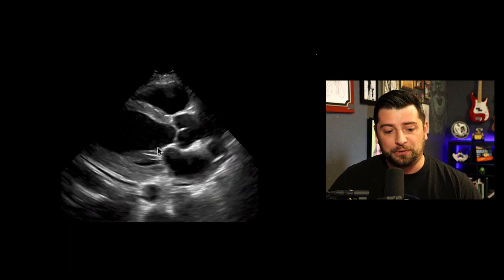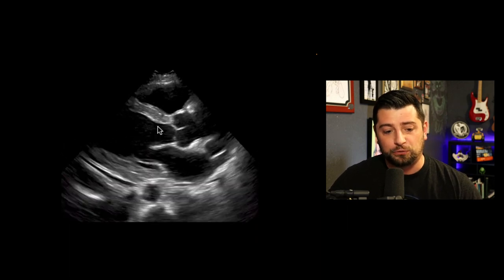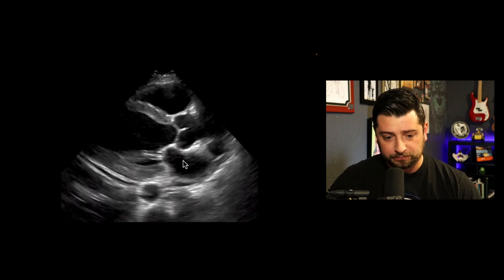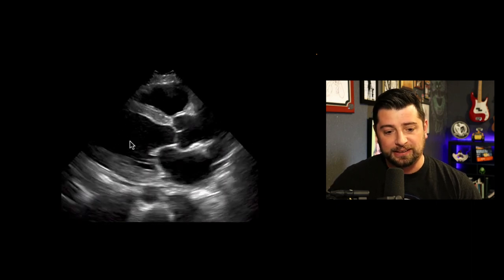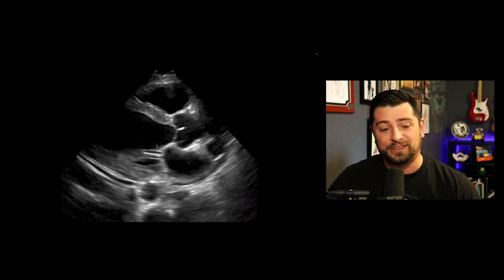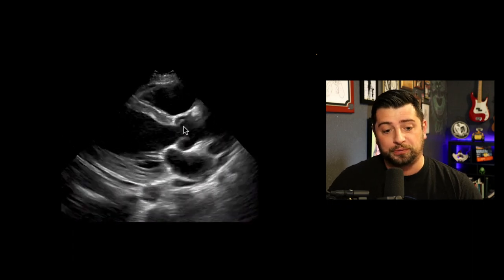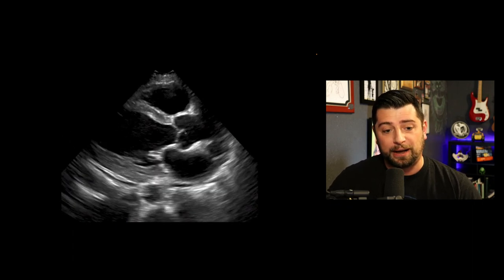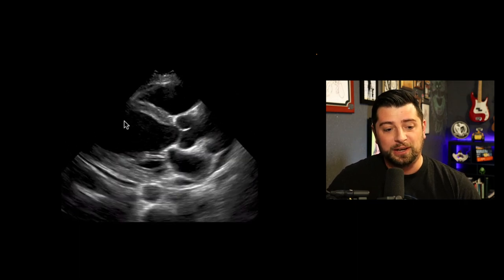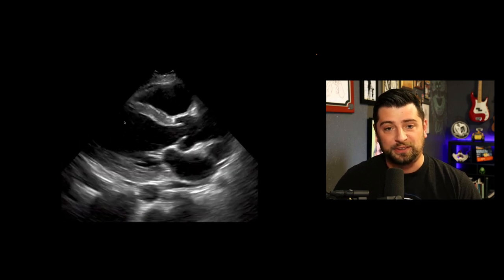We can look at the mitral valve and the ventricular muscle to see how well it's contracting. In this image, you can see how the mitral valve is really far away from the interventricular septum. That tells me there's not much of a pressure gradient between the left atrium and ventricle. We still have forward flow — the aortic valve is opening — but look at the ventricle. It's really not contracting at all. It's stiff, it's not moving.